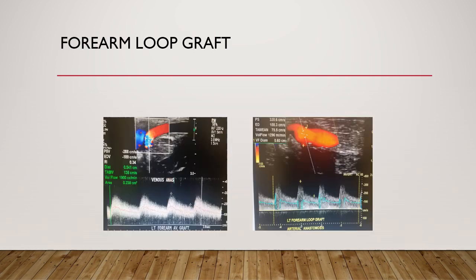Here is an image of a forearm loop graft, venous anastomosis. You can see this image was obtained close to the venous anastomosis. You can see the flow within this graft. This looks normal. You can see the next image there as well, is a left forearm loop graft close to the arterial anastomosis. These images show a normal velocity within a forearm loop graft.